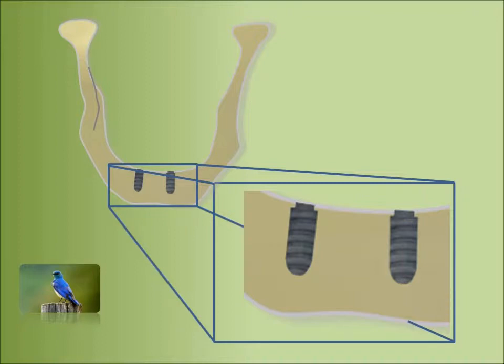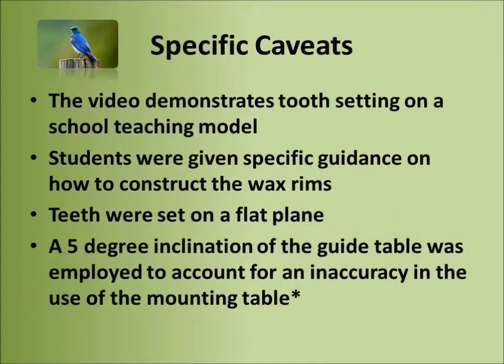As you might expect, a few caveats need to be mentioned. The video demonstrates tooth setting on a school teaching model. Students were given specific guidance on how to construct the wax rims. Teeth were set on a flat plane, and a 5-degree inclination of the guide table was employed to account for an inaccuracy in the use of the mounting table.